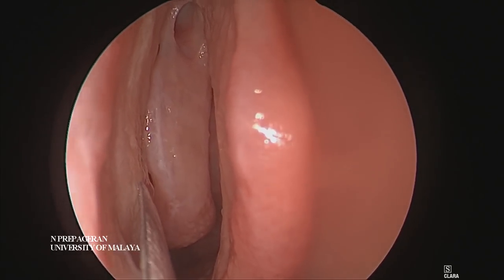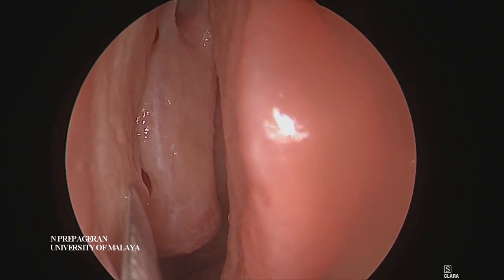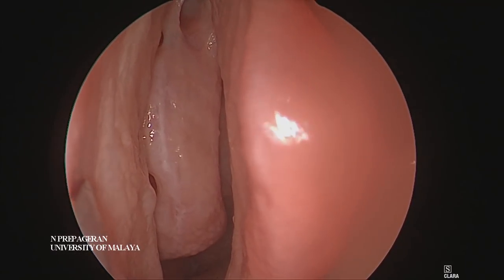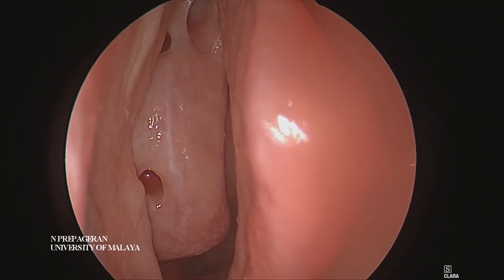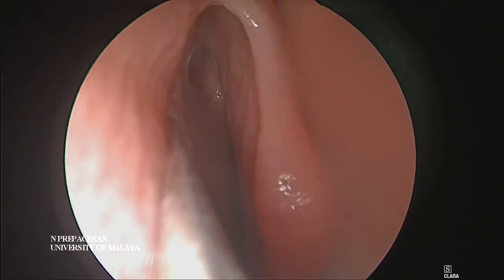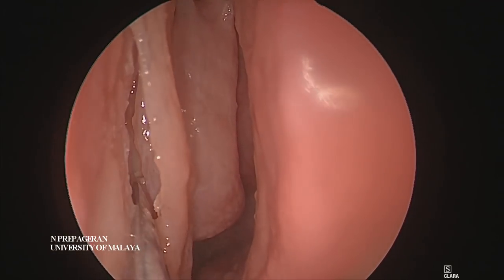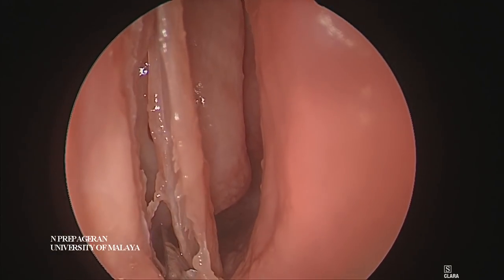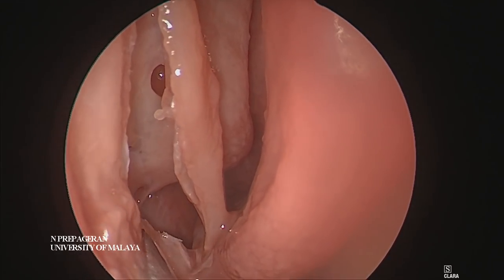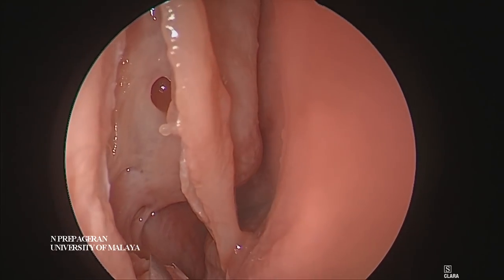Touch the uncinate process. Can you see where it's swinging? Where it's swinging is the attachment of the uncinate to the lateral wall. So if you put the Freer's elevator at the junction where the uncinate meets, and then you go up all the way, and then you go down all the way. This part is very important — you must swing and remove the tail of the uncinate process nicely.